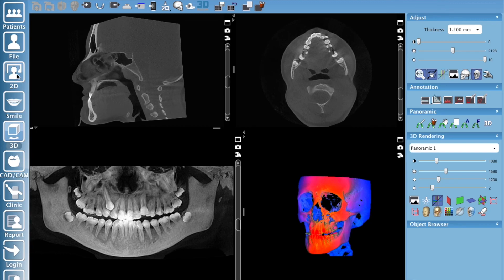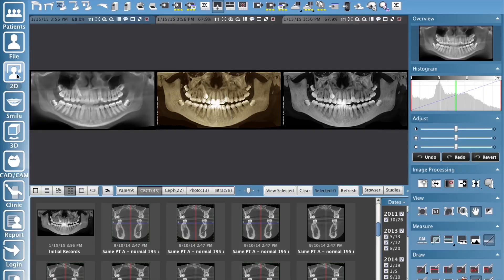When we go to our 2D module over here we have those images. Simply right click and copy — you can take these images and copy them to the clipboard, then right click paste right into your email. You don't have to do exporting to desktops or importing. If you want to bring it into a report template, for example for an orthodontist or oral surgeon — right click copy, open up your template, right click paste, and you're done. Simple and easy.